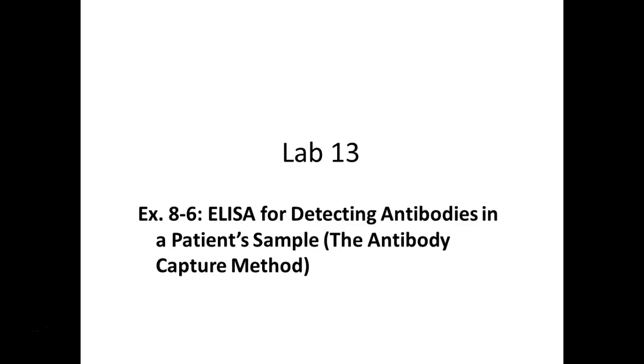You can do it to detect antigen, or you can use it to detect antibodies. Antibodies. Wasn't that the bonus question today? No. It was. It was. Right? All right. So sometimes referred to as the indirect ELISA, where the direct ELISA is directly detecting for antigen.